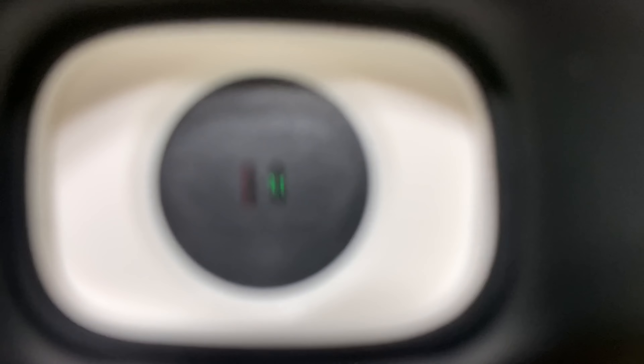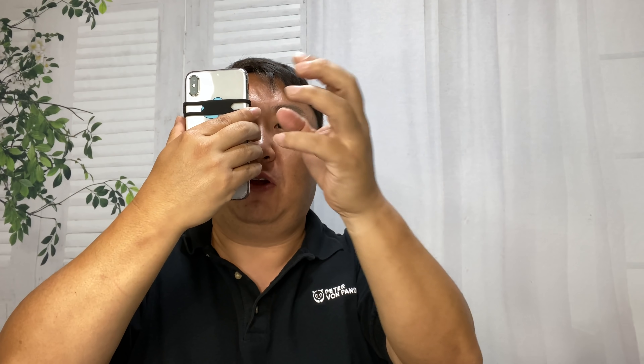Once you can see those lines, you're going to look off in the distance — at least six feet off in the distance. This is an important part, because if you're focusing right on those lines, the numbers you're going to get are going to be biased towards nearsightedness.